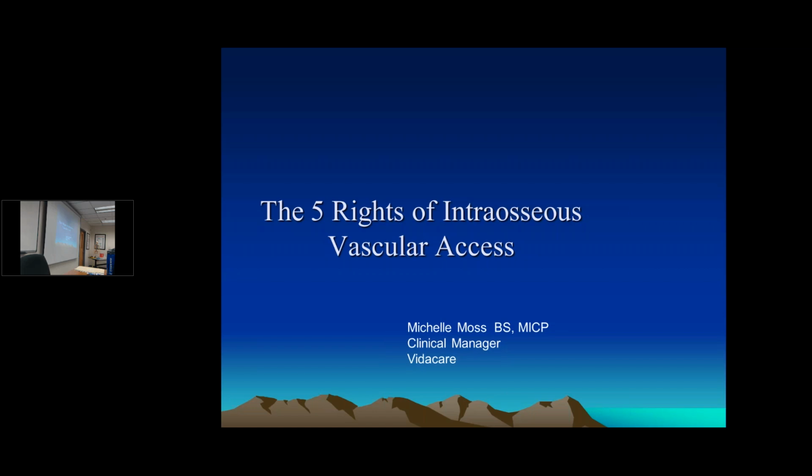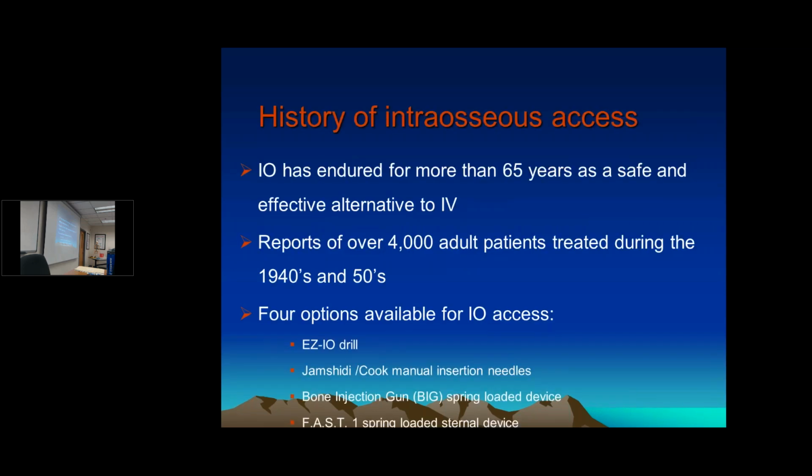Okay? All right, let's talk a little bit about IO. What's your experience there with IO? So has anybody done one? One, two, three, four. Okay. So the idea in terms of IO: a splendid way of getting a line in a hurry. You can have a line within 30 seconds or so once you start figuring out what you're doing. So we're going to start talking a little bit about IOs from where we came from.